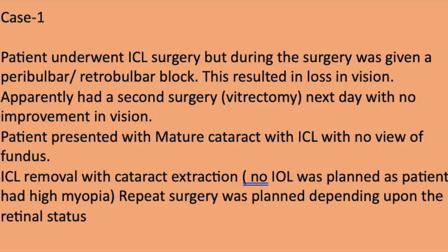Double Jeopardy. This video is about two cases which presented to me after having two surgeries with double the trouble. Case 1 is about a patient who underwent ICL surgery but was given an injection during the surgery with resultant loss of vision and was operated again.